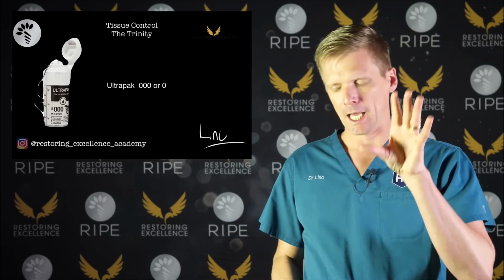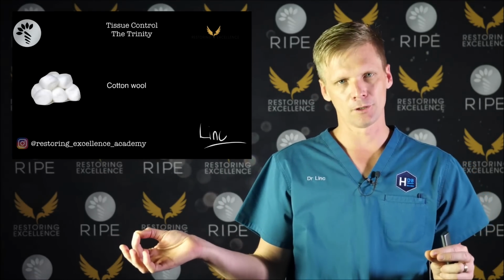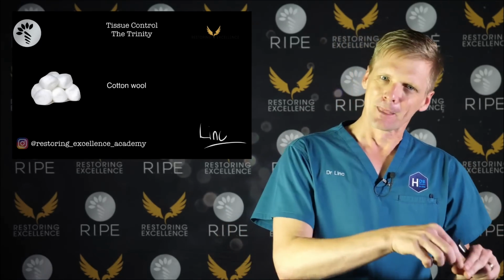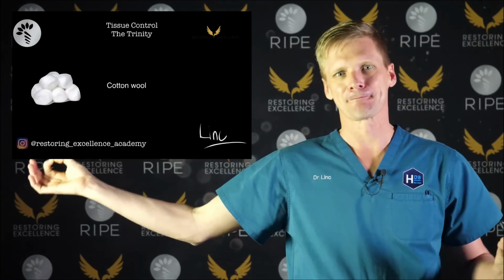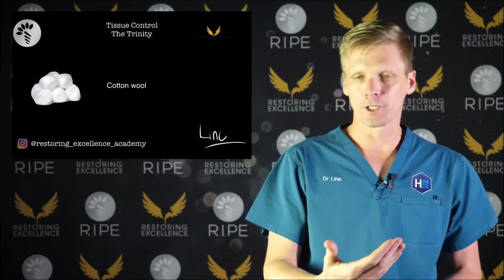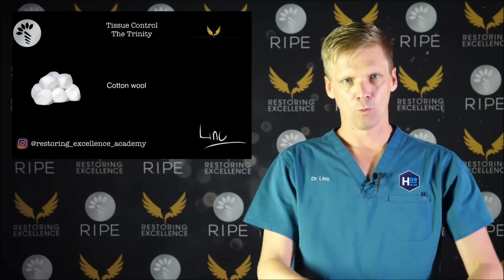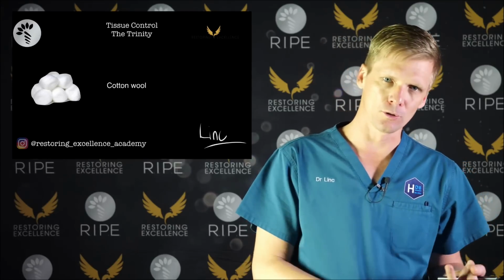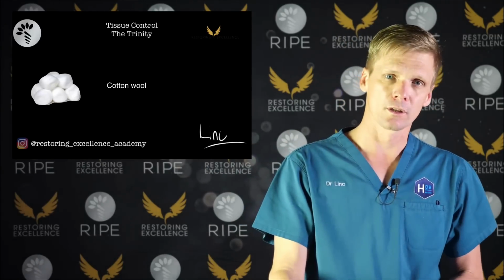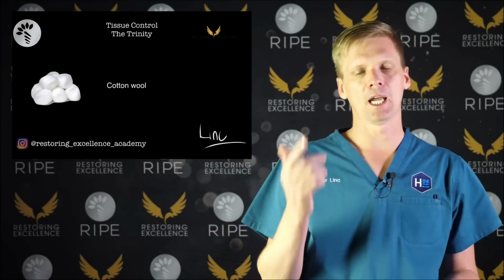And cotton wool. Now, I actually don't buy cotton wool balls. I pull the cotton out of the end of a cotton roll. One of my staff was trying to do it for me today, and she was trying to use tweezers. I'm not sure why, but I don't use tweezers. I just grab it with my finger and I pull it out. That's the best way to get the cotton wool out for doing tissue control. Now, cotton wool, you soak it in the Viscostat Clear and then you pack it wherever it's a bloodbath. So you can't use cord. When you prep, sometimes there's a subgingival margin and it's bleeding everywhere. You can't use cord when you've got blood going everywhere. You have to use something that will pack a wide area, and that's when I use cotton wool.